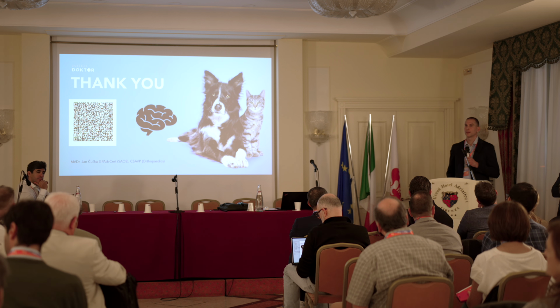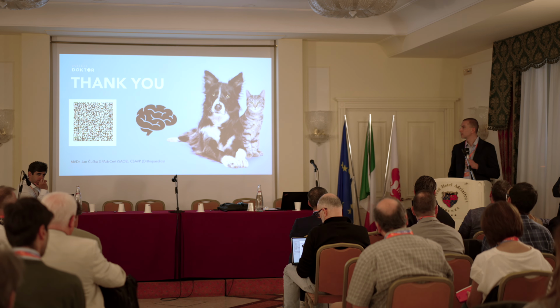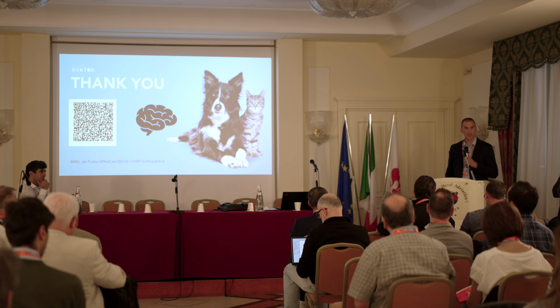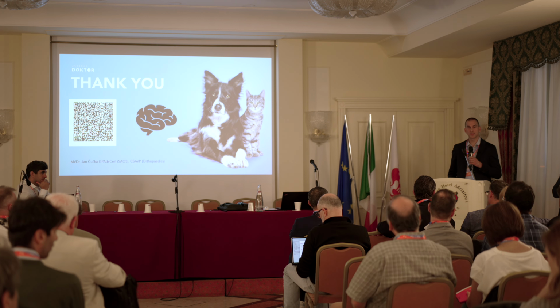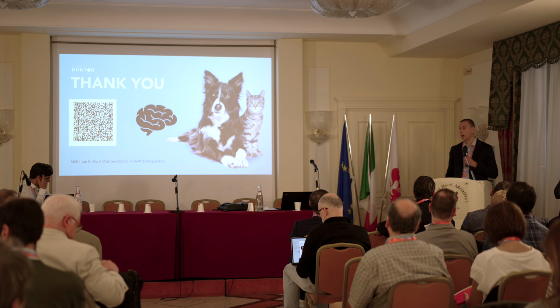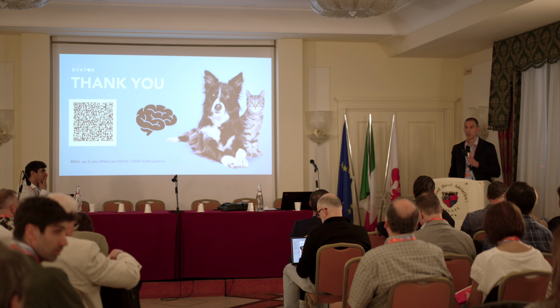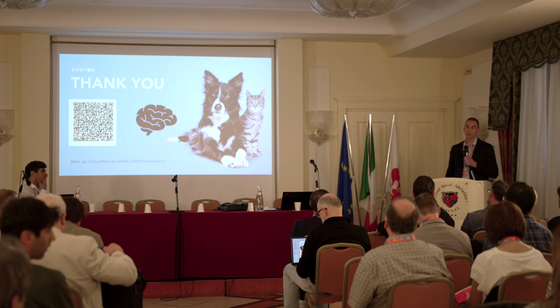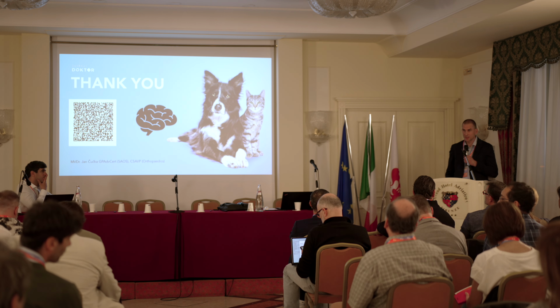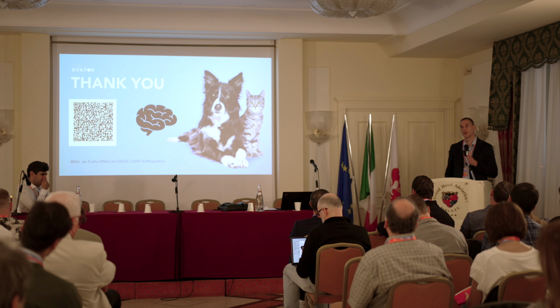My standard approach is to do a standard neuro exam, localize the lesion, to know where I should look, do a CT standard plane survey, then take CSF, then do myelo.